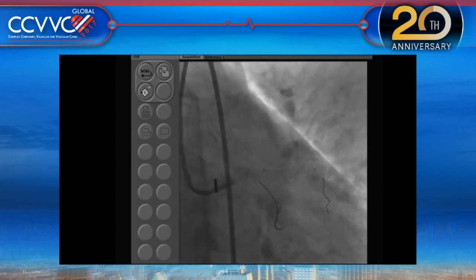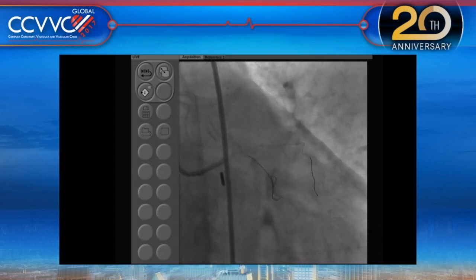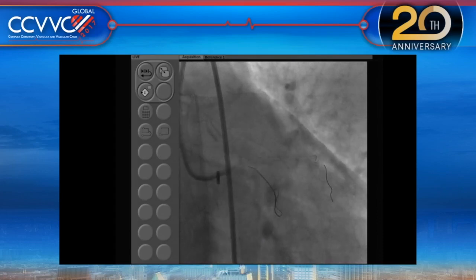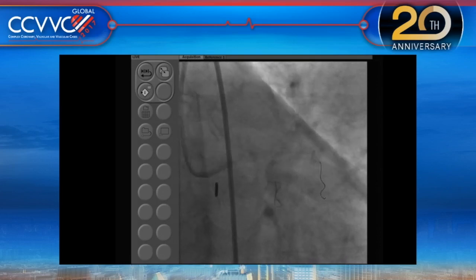It's mainly, as Kinney said, the arc that we are looking at. That information is good enough to decide. And even in 4 or 5 millimeter arteries, visibility is quite good. Proximal at least, the other one is making a turn there. Get us a picture of the stent. The picture is excellent. Okay, good.